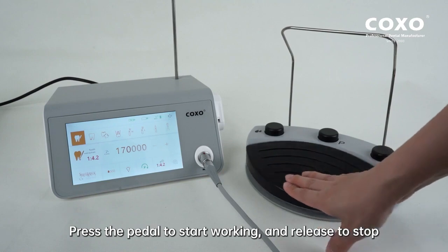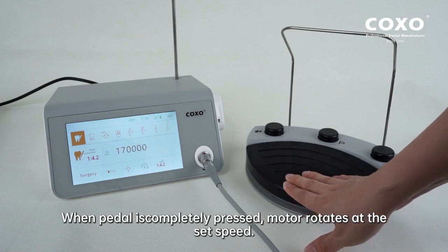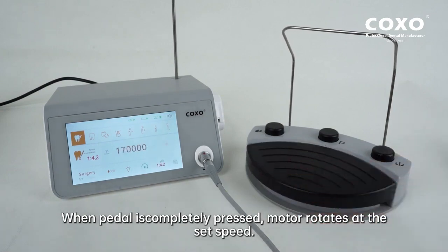Press the pedal to start working and release to stop. The speed of the motor depends on the pedal pressing force. When the pedal is completely pressed, the motor rotates at the set speed.